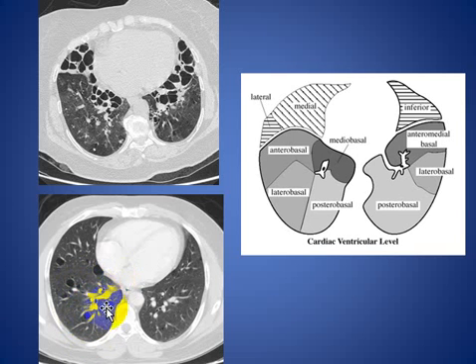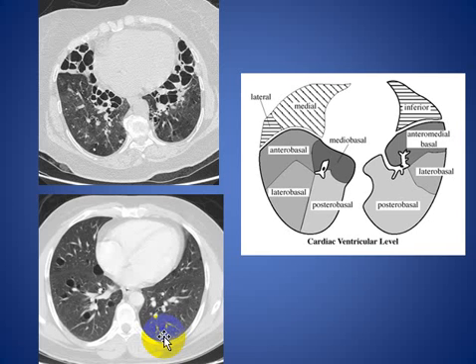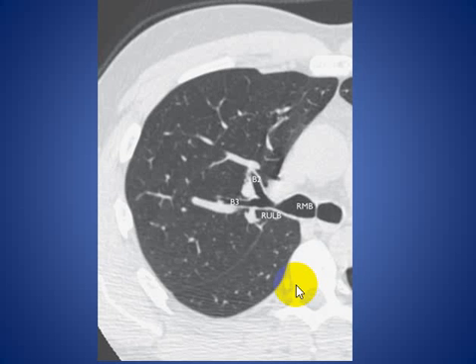The remaining area here is the medial segment of the right lower lobe. On the left side, we also divide into three parts: the upper third is the anterior segment, the middle third is the lateral segment, and the lower third is the posterior segment. Note that there is no medial segment in the left lower lobe.